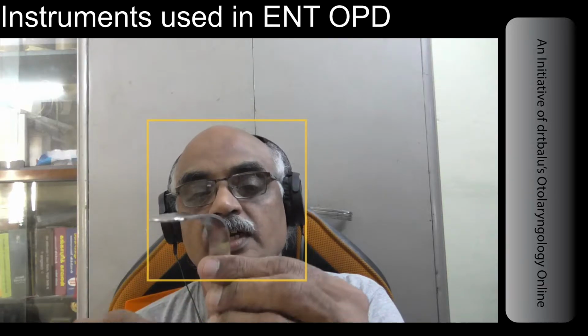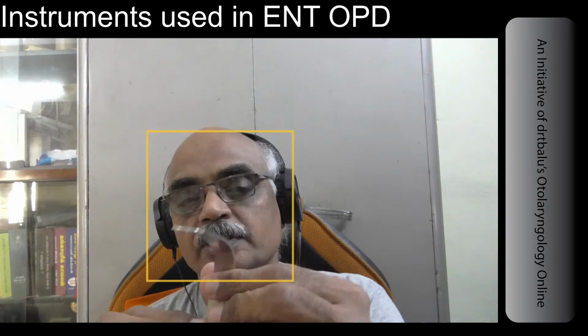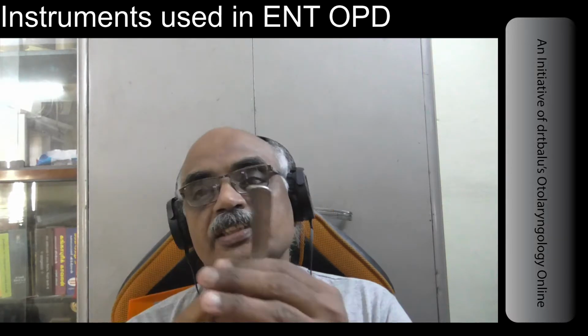You just depress the tongue, and the oral cavity will become fully visible. Towards the handle, the tongue depressor is slightly curved. This curvature, the tip or the curvature, can be used to retract the cheek, to examine the wisdom tooth area and the parotid drainage area. All these things can be done using this tongue depressor.